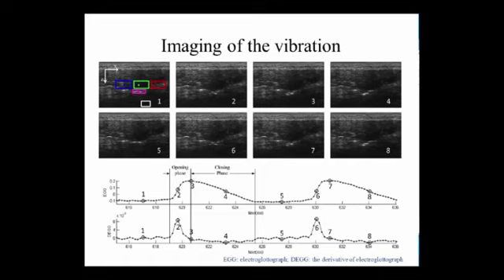The electroglottogram down here and the ultrasound images are captured simultaneously so that we could locate each frame on the time axis here. And here you may already find that this is the echoey curve of the edge of the vocal fold. And the edge of the vocal fold changes rapidly during the vibration because the vocal fold vibrates intensely during voicing. And on the other hand, here the false vocal fold seems don't move at all. And so we want to make sure whether it vibrates or not.